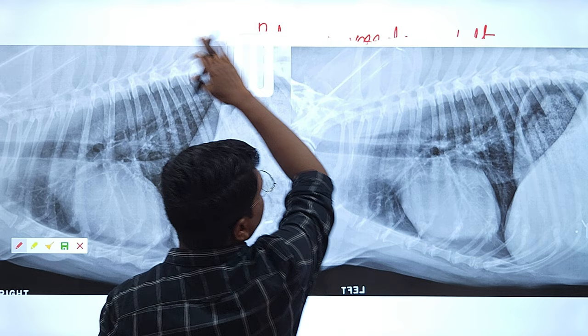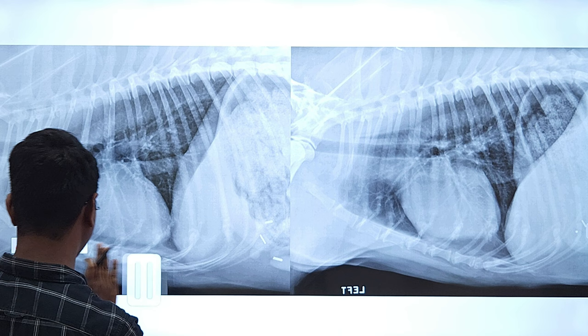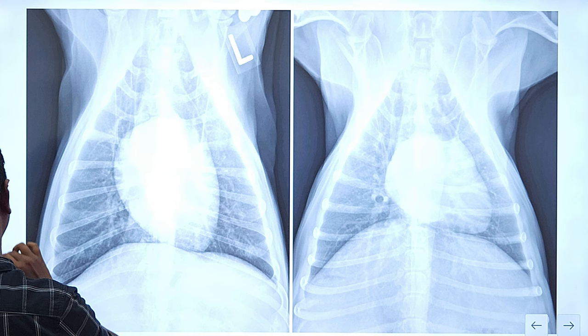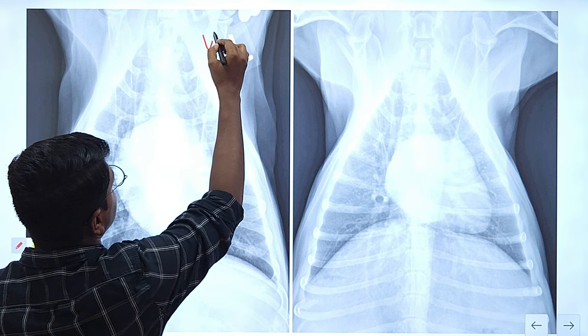This is all about the lateral views. Now let us go to the dorsal ventral and ventral dorsal views. Can you tell which one is which? This is the ventral dorsal, and this is the dorsal ventral. Let us start with the lungs, like we did in the lateral view.